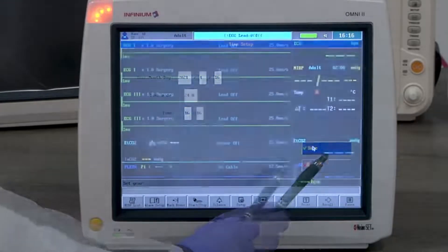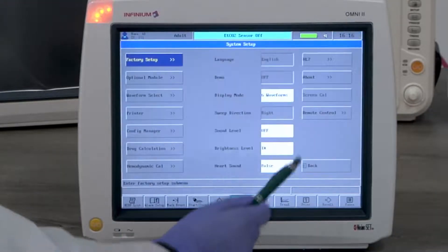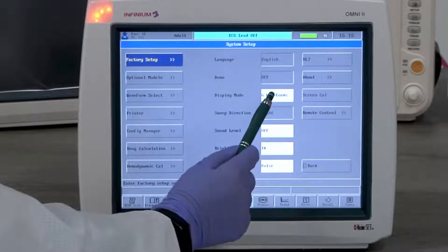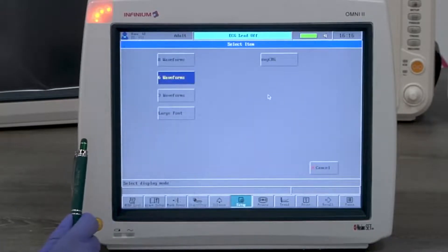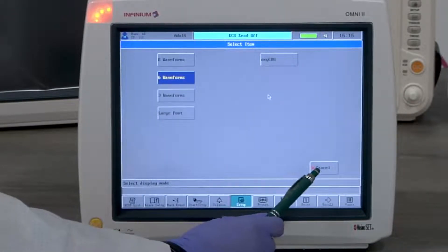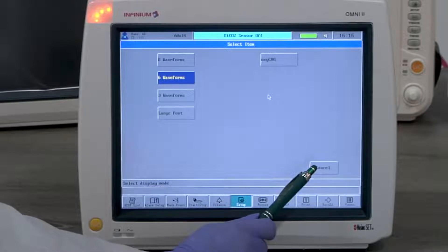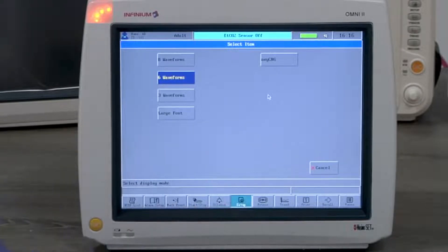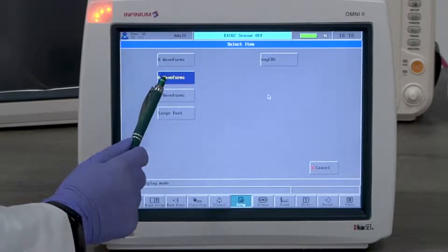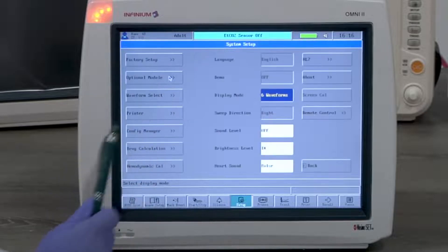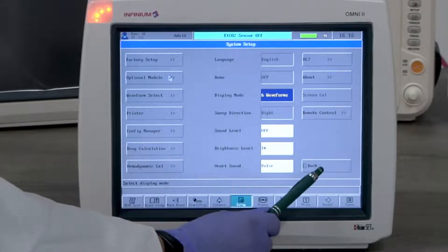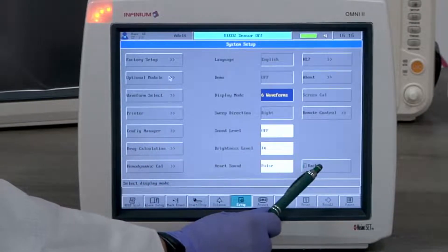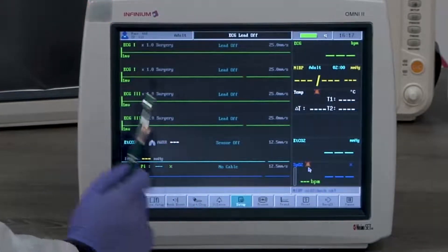For waveform display, go to setup menu, display mode, and then select according to your preference. We have 5 display modes: 3 channel, 6 channel, 8 channel, large font, and oxy CRG. Now let's look at ECG monitoring.